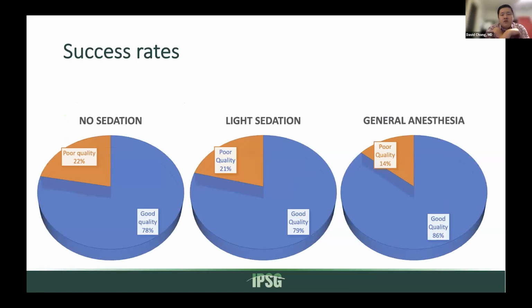And so we looked at the ones that had sedation versus not, and you can see here that light sedation didn't really change our numbers very much, just a slight improvement.